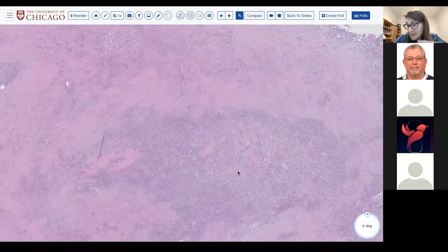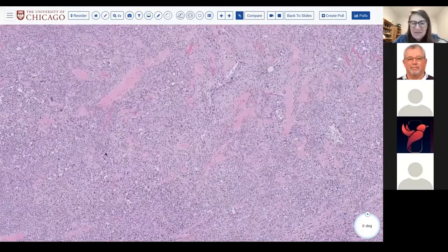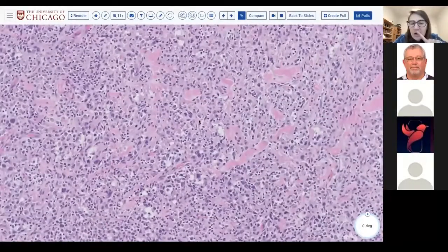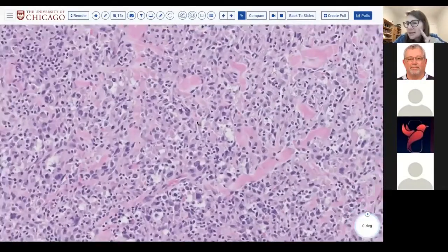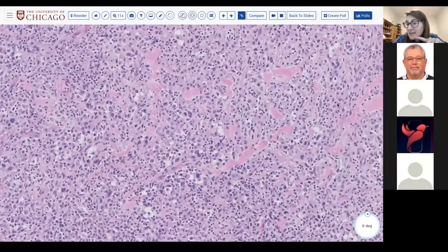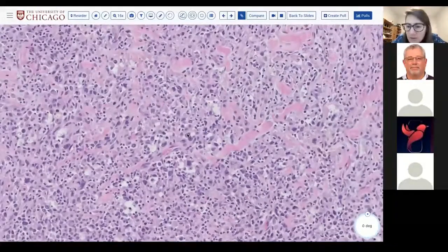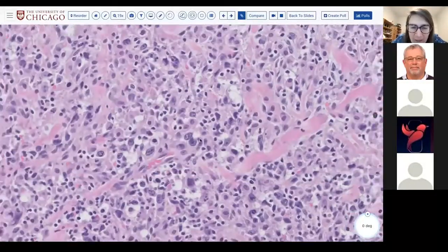I don't know if you guys still have to answer my question of whether the adamantinoma-like Ewing's can occur primarily in the parotid, or if you would consider this, in that differential diagnosis, to be a metastasis, because honestly, I don't know the answer to that question. So all you experts out there, if you want to respond, you can. All right.